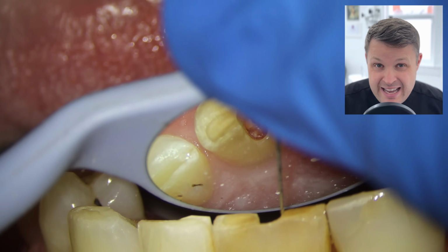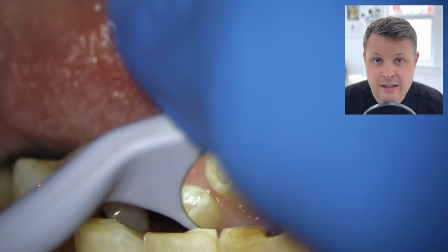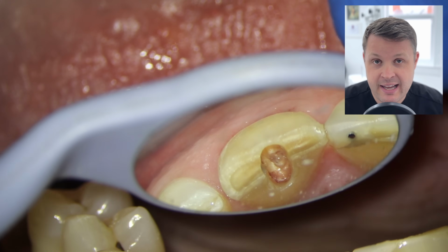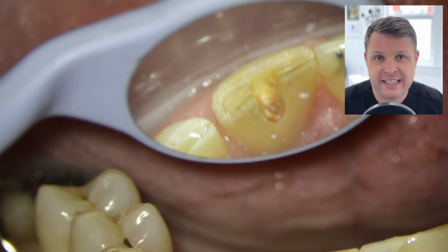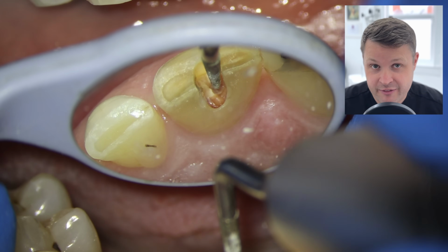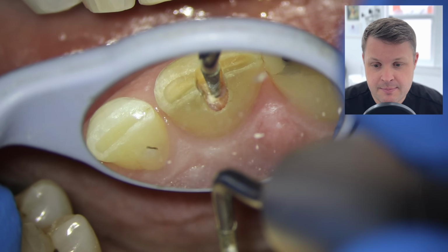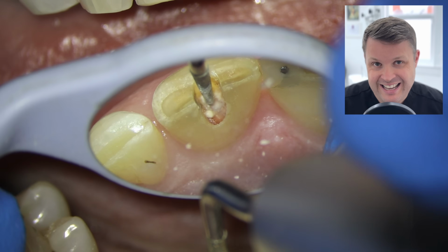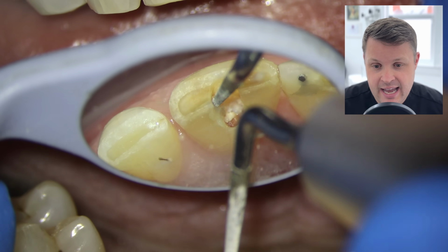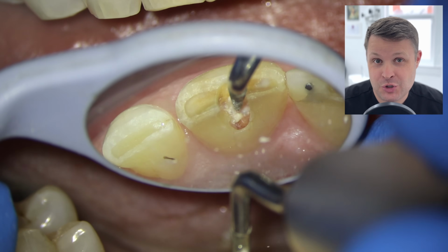Straight away, I can maybe feel like there's some sort of orifice, so I'm going to get a hand file in this orifice to see if I'm getting any kind of stick at all, and I'm not really getting any stick. I think when I've been using this high energy ultrasonic, I've created a false orifice, and I'm going to move over to my diamond tipped ultrasonics, and in this case, I feel like I want to aim more palatal. This, of course, is where I get into trouble.